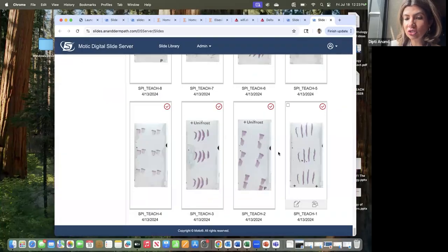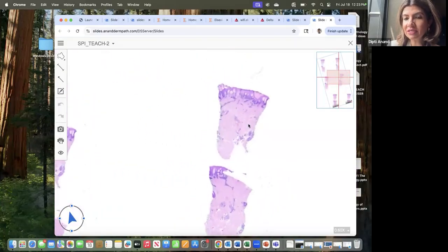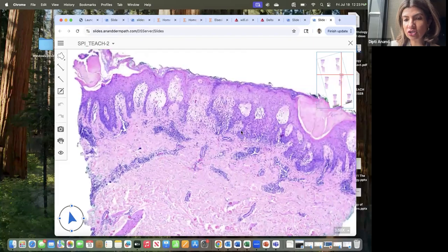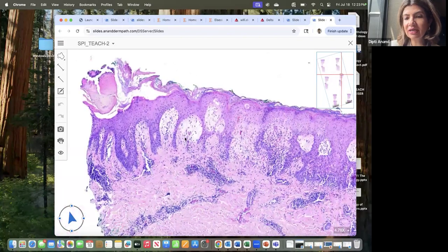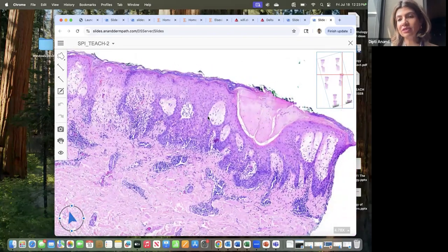Now, it's pretty traditional to describe or quantify the amount of spongiosis on a biopsy. So acute spongiotic means active spongiotic changes with dermal edema and presence of these intraepidermal spongiotic vesicles. So you can see the nice dermal edema and these intraepidermal spongiotic vesicles. So this is something that would actively blister in the patient.